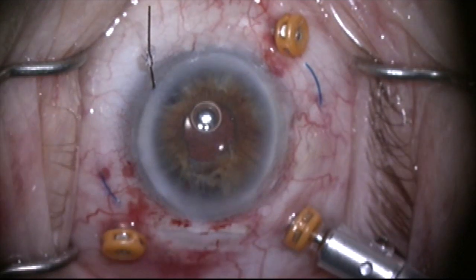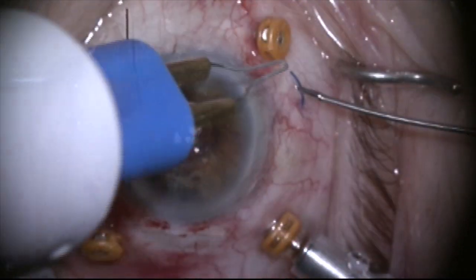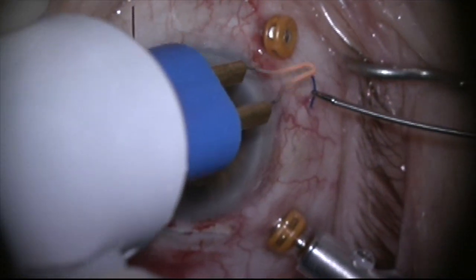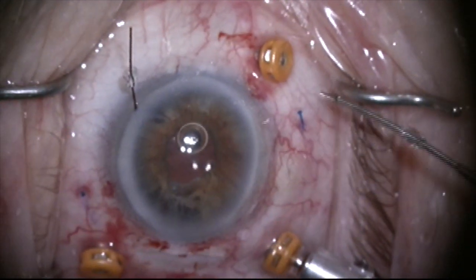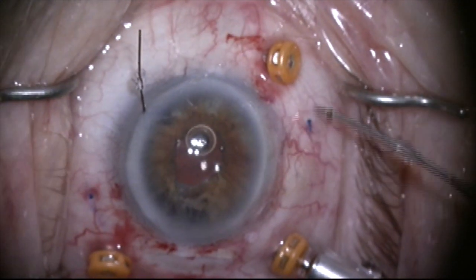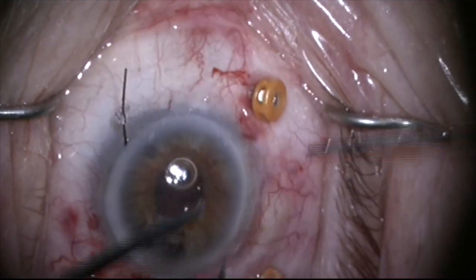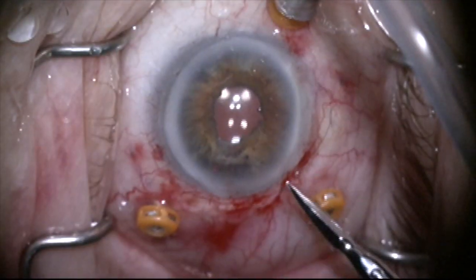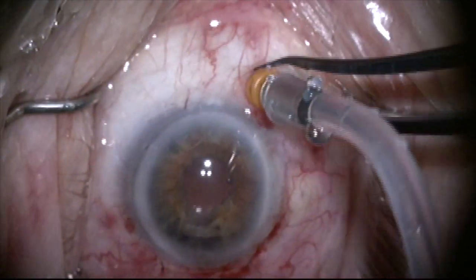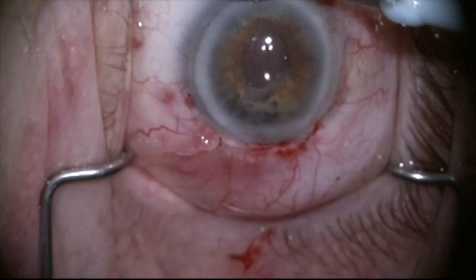I grab the second haptic and melt the tips. You can see I'm coming out right adjacent to the filtering bleb at 12 o'clock — there's a trabeculectomy bleb there — and this small opening won't affect it. I tuck the haptic through the conjunctiva next to the functioning filtering bleb, massage the haptics into the scleral tunnels, and close the conjunctiva with 10-0 nylon. The incision was self-sealing so no closure was needed there. Trocars are removed and the case is completed.